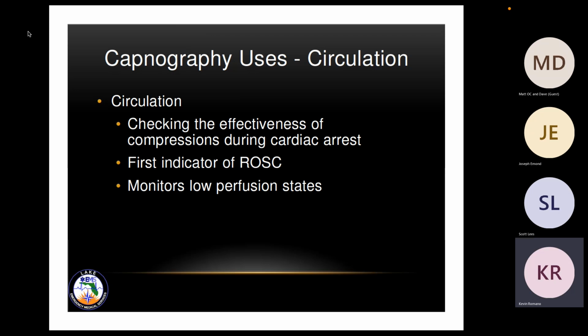So if you have a patient who is, let's say, asystole or VFib or PEA, and you see an end tidal spike to like 50, 90% of the time, if not higher, they're going to get a pulse within 2 minutes. So check for a pulse. It also shows good effective CPR. So if you have a Lucas device and you have someone on end tidal, that device does such good compressions, it'll actually develop a blood pressure on patients and show good perfusion status with end tidal as well.